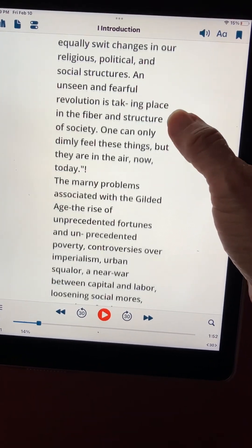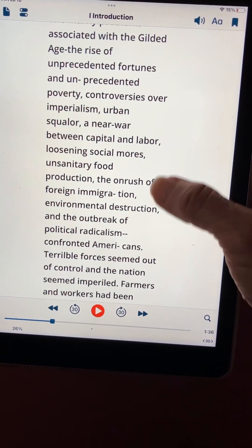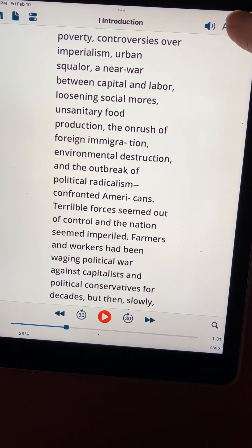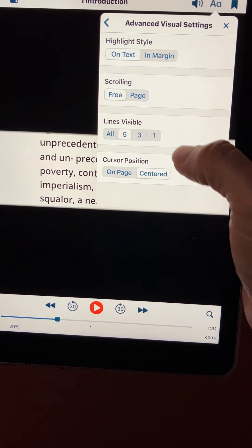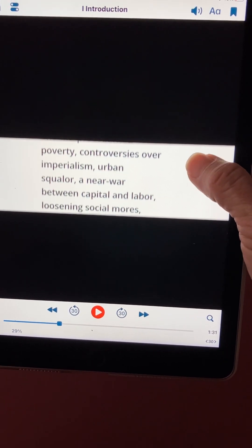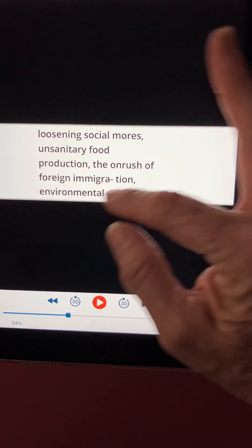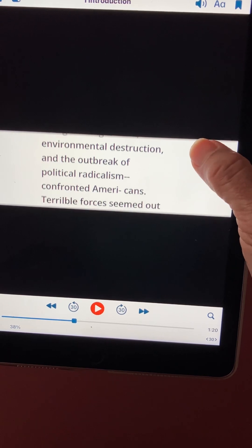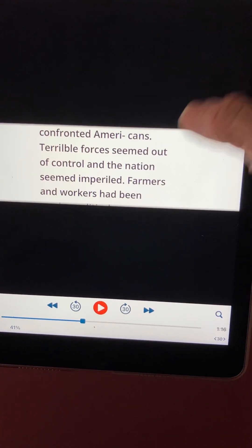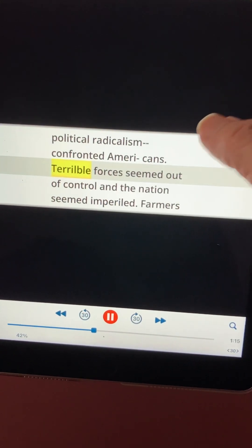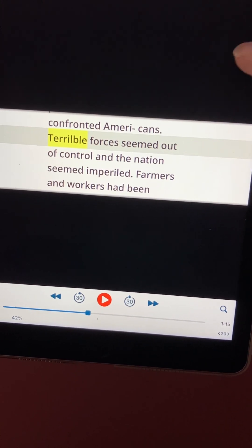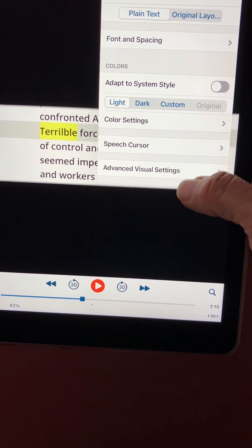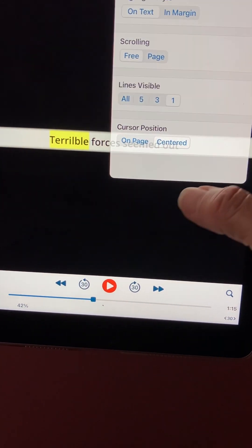That can just be read off the screen by scrolling, or there's probably a page turn mode also. Something else that might be useful is under advanced visual settings — that's the number of lines visible. If I change this to five, then we have all of our print just in the center of the screen. You could still read by scrolling, or use the speech. You also have the options to change the colors or to turn off the visual highlighting but still listen to it.